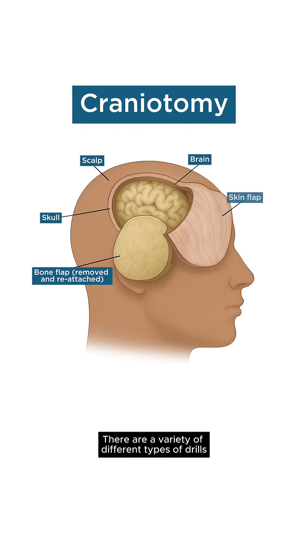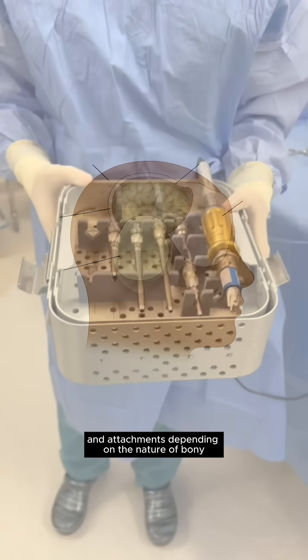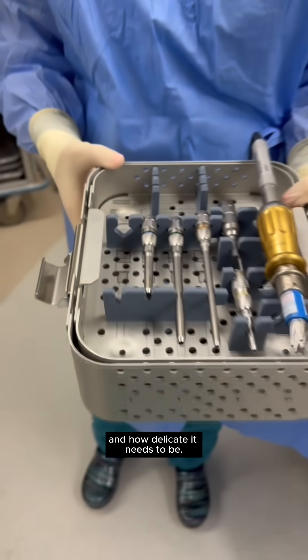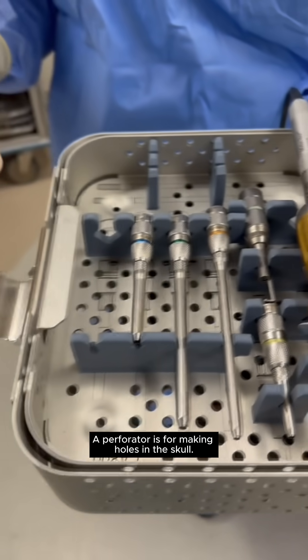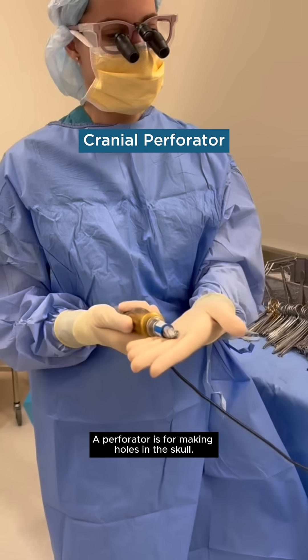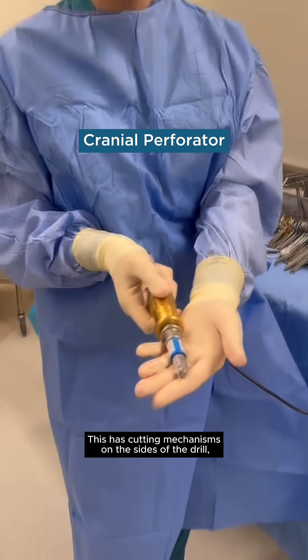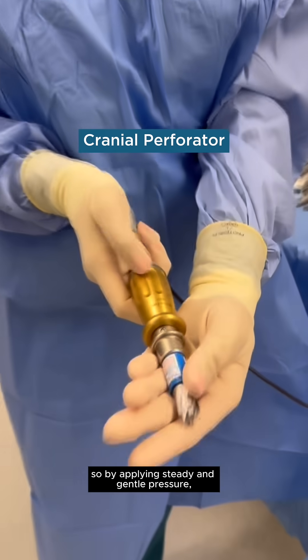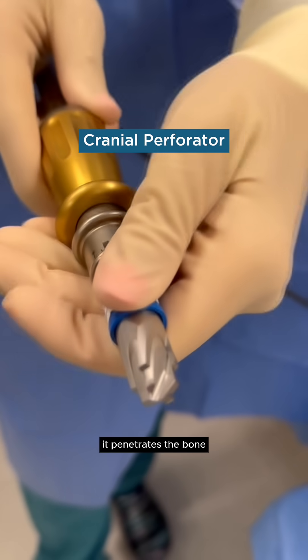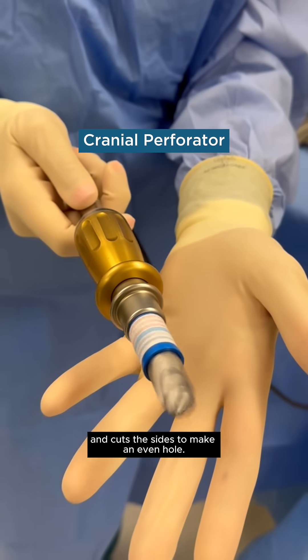There are a variety of different types of drills and attachments depending on the nature of bony work that needs to be performed and how delicate it needs to be. A perforator is for making holes in the skull. This has cutting mechanisms on the sides of the drill, so by applying steady and gentle pressure, it penetrates the bone and cuts the sides to make an even hole.